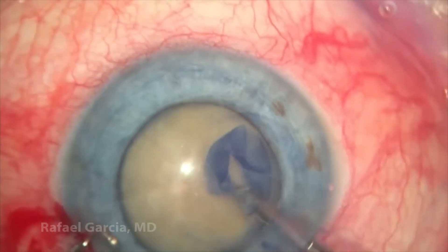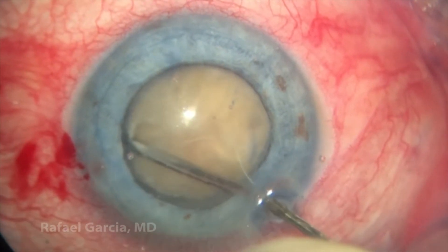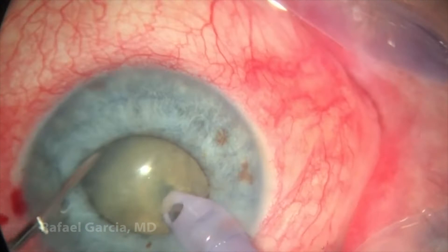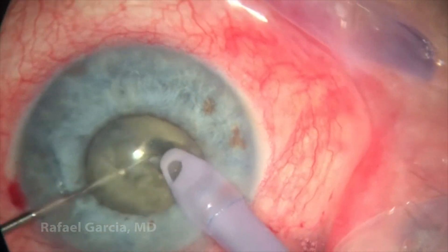A hydrodissection is performed with a blunt cannula and balanced salt solution. However, as soon as we go inside the anterior chamber with the phaco probe, this pupil becomes fairly small and miotic.